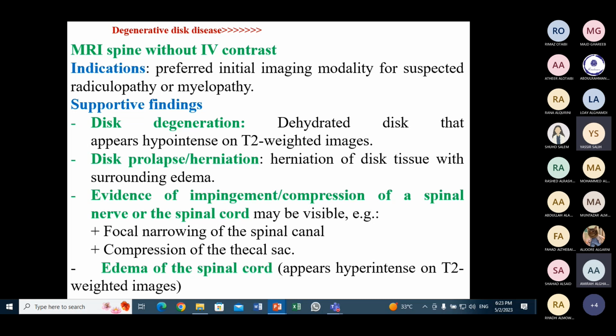اذا لاحظ انه اذا البيشنت جانا بباك بين you have to do plain X-ray. لأن بسط لكم الحكاية دي، اذا البيشنت جه بباك بين نعمل plain X-ray to assess the spine، نشوف هل في degenerative disc space changes، disc space narrowing، osteophyte and end plate sclerosis. دي بنقول إنه البيشنت ده عنده disc degenerative changes. طيب متى نعمل MRI؟ اذا البيشنت كان عنده symptoms بتاعت myelopathy or radiculopathy، حتى لو كانت الاكس راي نورمال you have to perform this MRI. يعني ما بنعمل MRI الا يكون في indication.